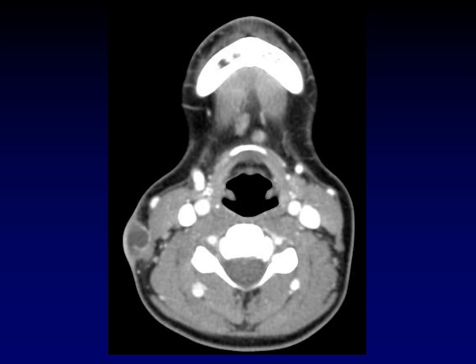Sometimes we encounter a mass in an unusual location — this one is very superficial. The platysma muscle is being displaced deep by this lesion. Superficial to the platysma muscle means superficial to the superficial cervical fascia, indicating the mass arose from the dermis or subcutaneous tissues. This is actually an infected sebaceous cyst.